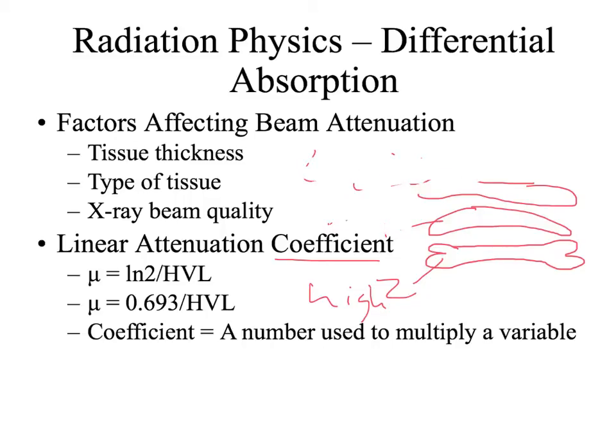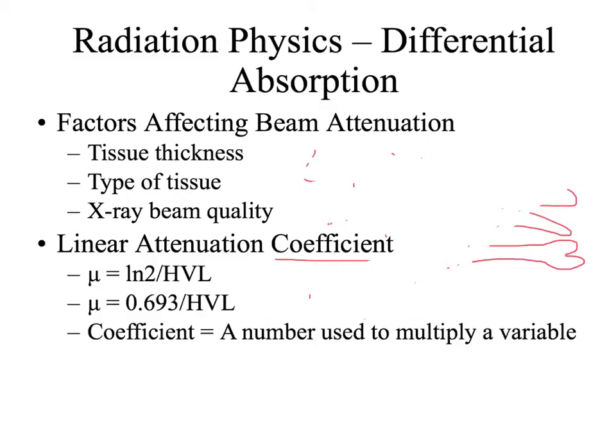So the reason I want us to think about that for just a sec is thinking about linear attenuation coefficients and stuff. I'm not going to ask y'all to work this formula out, right? Yes, but the ARRT may not be so kind. They may ask you to be able to work this formula. So we need to know how to express this formula and how to think through this formula.